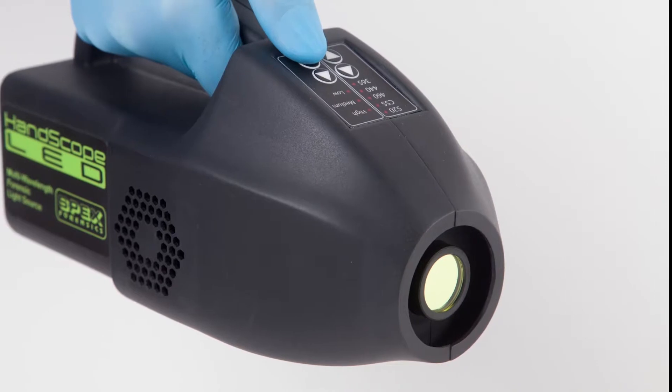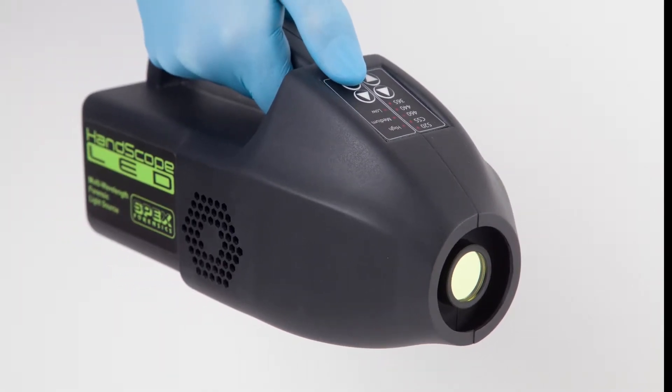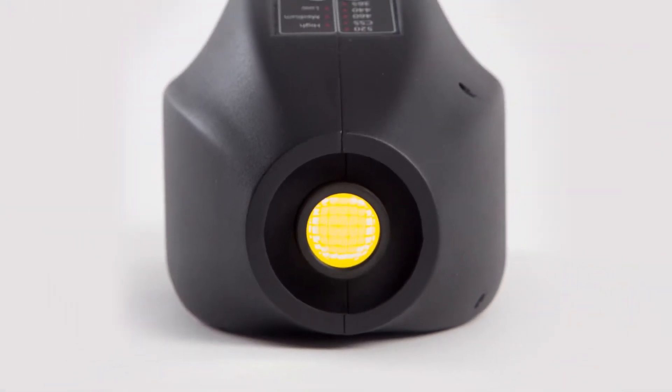Celebrating 20 years of innovation, Spex Forensics introduces the HandScope LED — the first LED worthy of being called a forensic light source. The new HandScope LED is the first of its kind with five wavelengths inside one instrument.